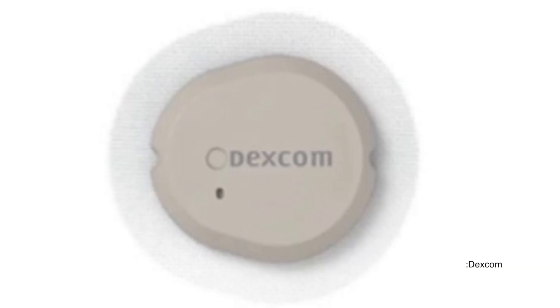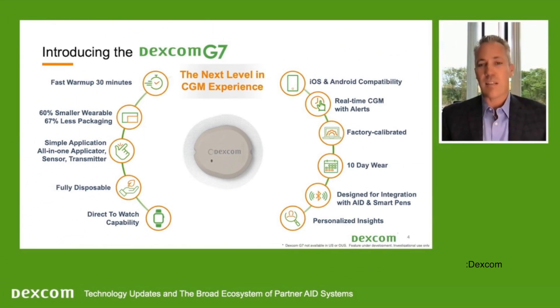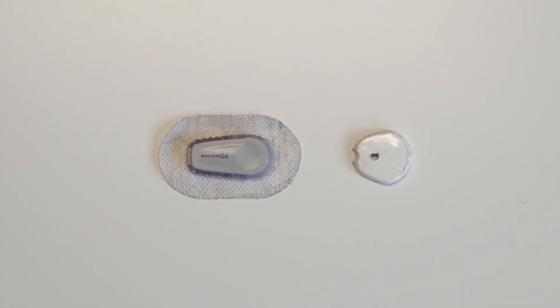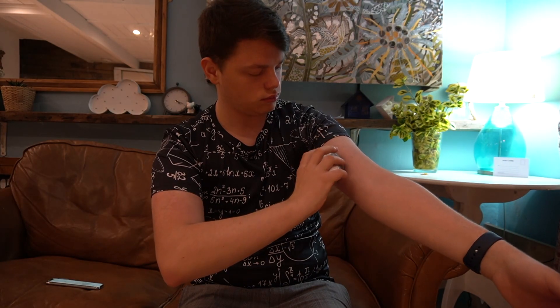Dexcom G7 is arguably the biggest jump generation to generation in Dexcom's history because they completely changed the form factor. It's an all-in-one design where the transmitter is built into the sensor, similar to how Freestyle Libre works. The sensor itself is 60% smaller when compared to G6, which is great news in terms of size. This mock-up compares G7 to the G6. Beyond size, it should be approved for arm and belly, just like Dexcom G6 is in many places all over the world today.